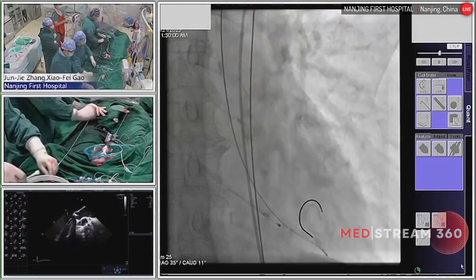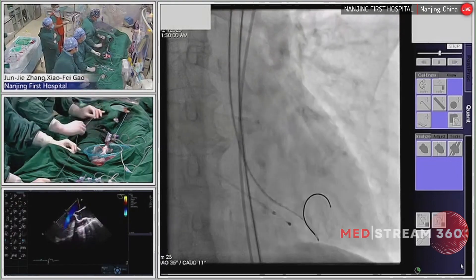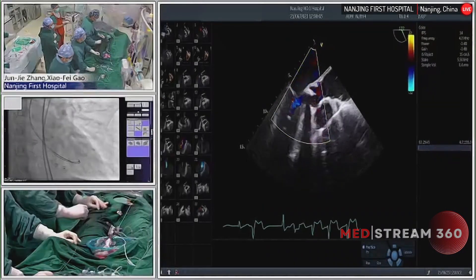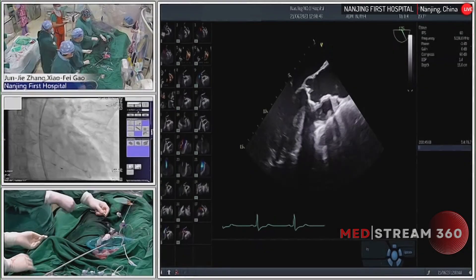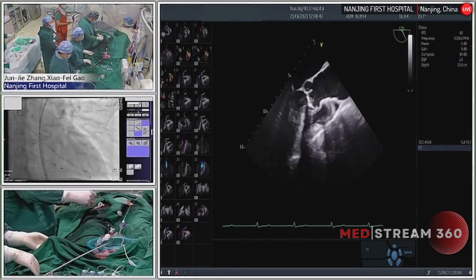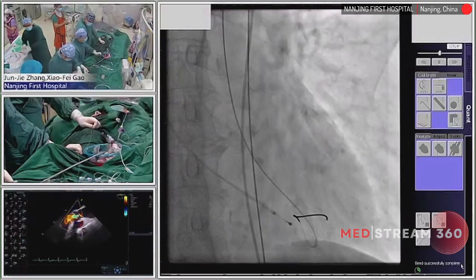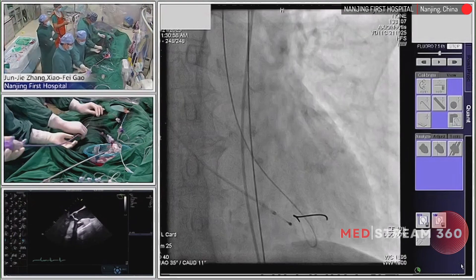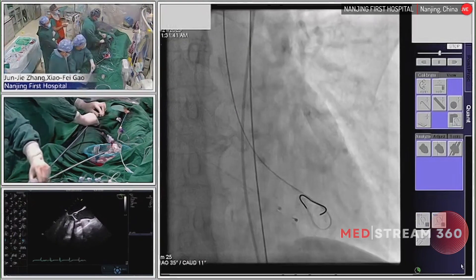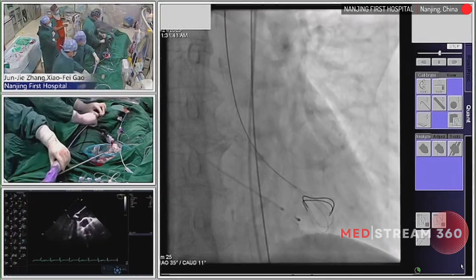It is a quite successful BAV. However, the leaflets of the valve are quite thickened and calcified, and very hard to open. After BAV, the gradient was decreased. Now the next step: we are advancing the self-expanding valve. According to the CT analysis, we will use a 23 Taurus valve — it is a third-generation self-expanding domestic valve.